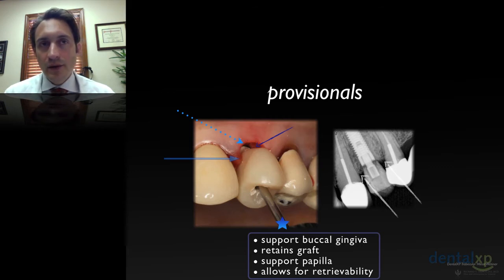So if you look at this periapical, or this bitewing radiograph, you could see the interproximal bone. I see this very often. When I provisionalize and leave the provisional in place, I see very little bone dieback, if any, over time.